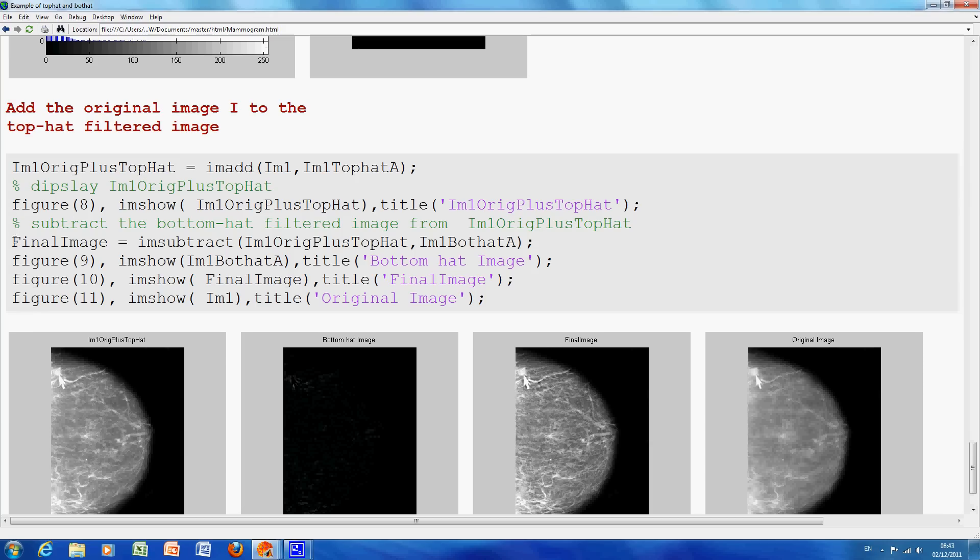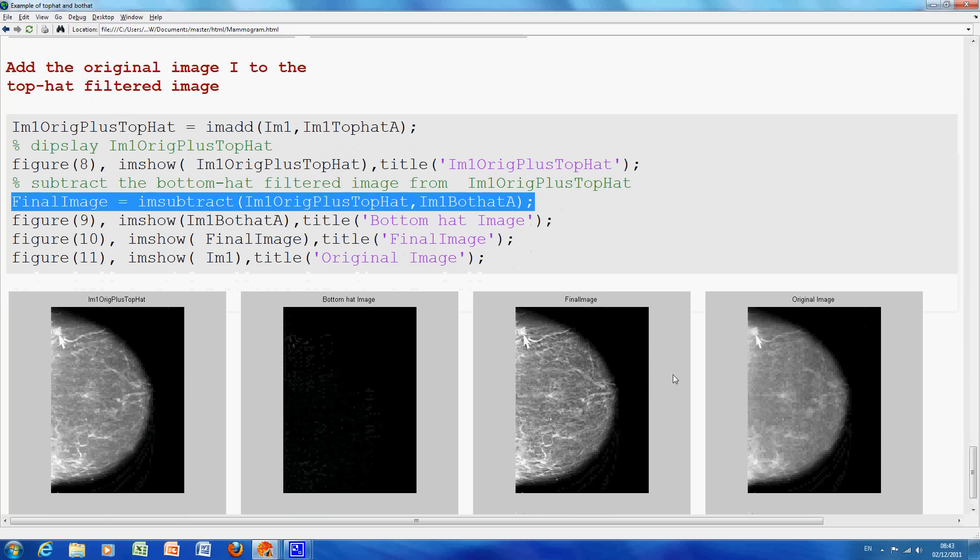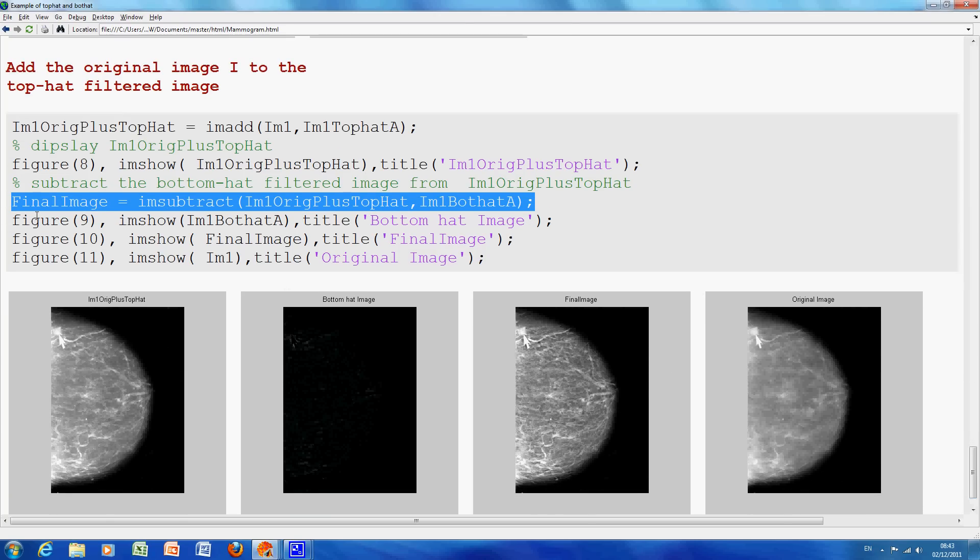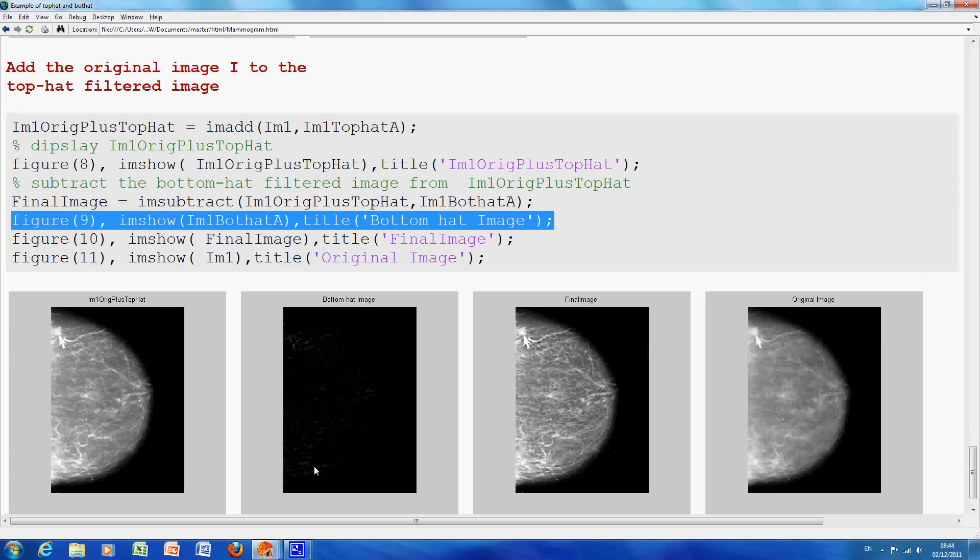Figure nine, or so not figure nine, just before figure nine, the final image, it's IM one plus the TopHat, less the BotHat. So, on figure nine here, which I mentioned a little earlier, there's the BotHat image, which is a bit hard to see, but you can see there are little flecks of white just there, and those little flecks of white are the intensity drops.